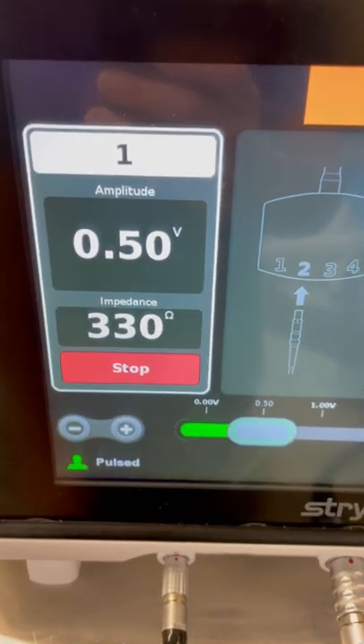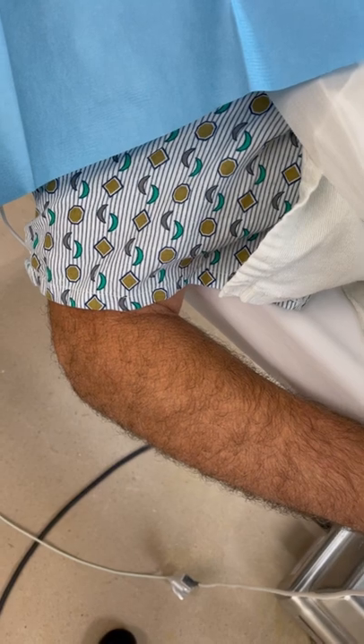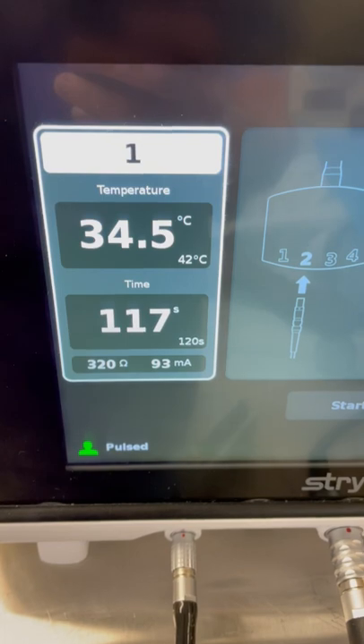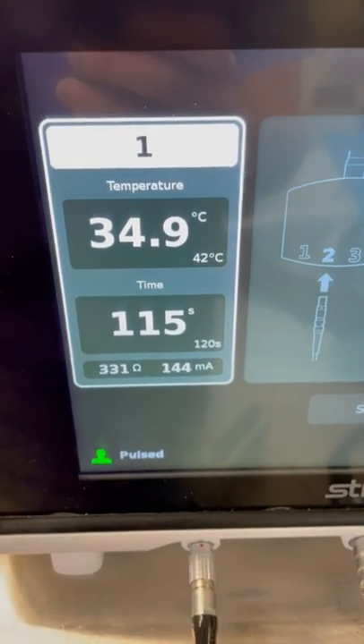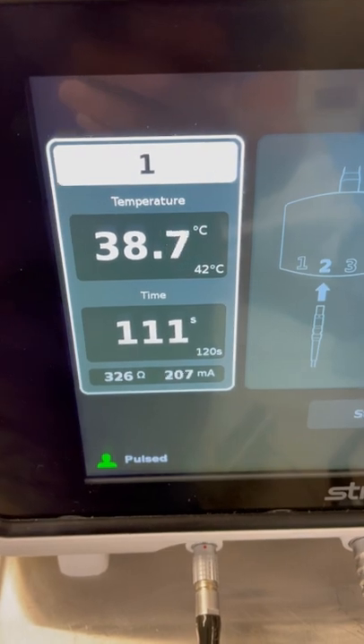Here you see motor stimulation of the nerve and you see that we're twitching the muscles of the nerve so that we're in the right position. Now we're performing the ablation at 42 degrees Celsius, so it doesn't hurt the nerve but it only stuns the nerve.